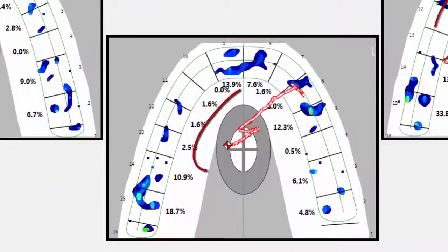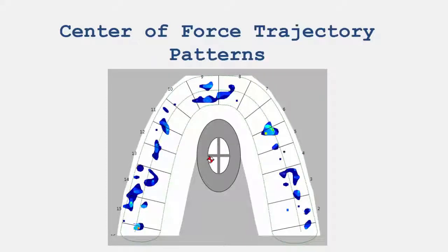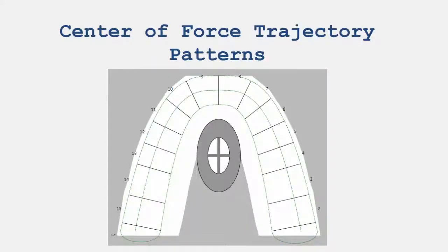The trail left behind the marker is called the center of force trajectory. Based on how the center of force moves during the closure, the dentist can get an idea if the patient's bite is well-balanced or where the occlusion may need improvement.